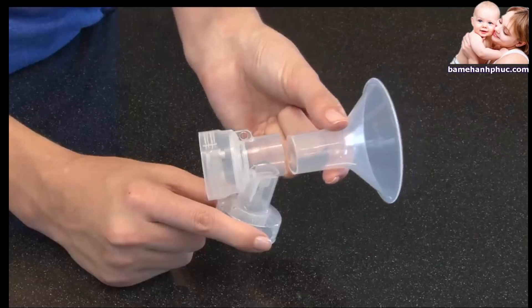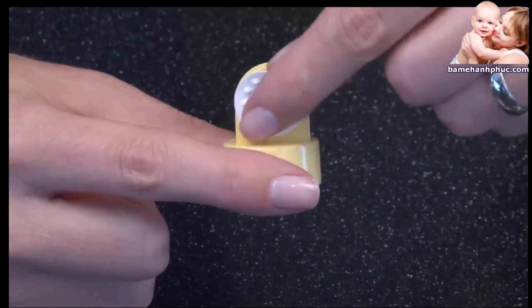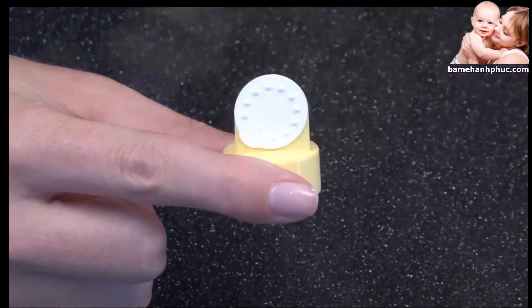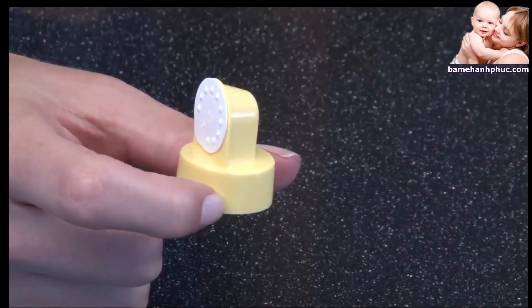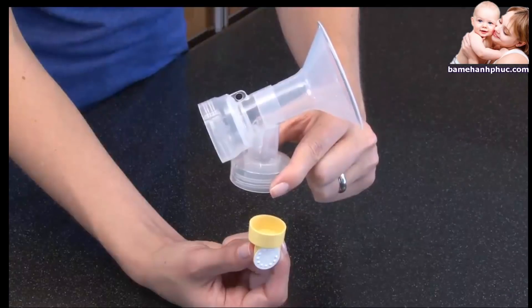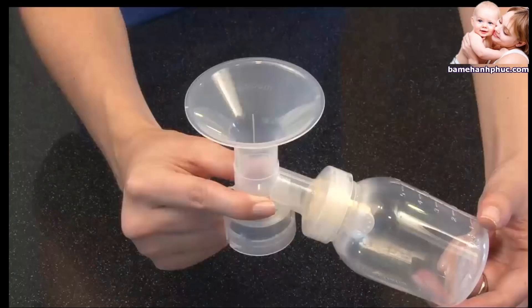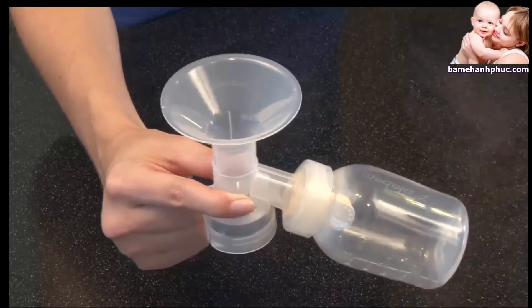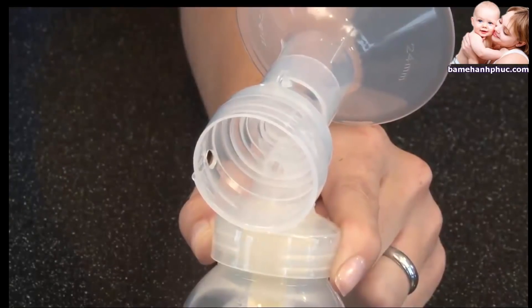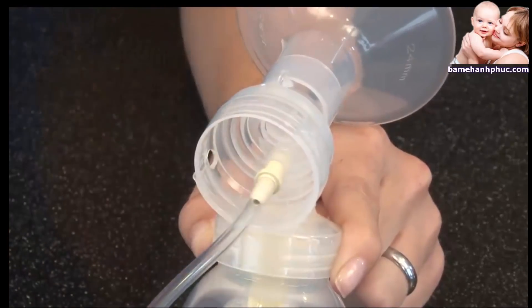Begin by securely attaching the breast shields to the connectors. Then attach the white membranes to the yellow valves — the white membrane must lie flat against the yellow valve. Push the assembled yellow valves and white membranes into the breast shield connectors, and screw the bottles onto the bottom of the breast shield connectors. Insert the hard yellow adapter ends of the tubing into the openings in the back of the breast shield connectors.